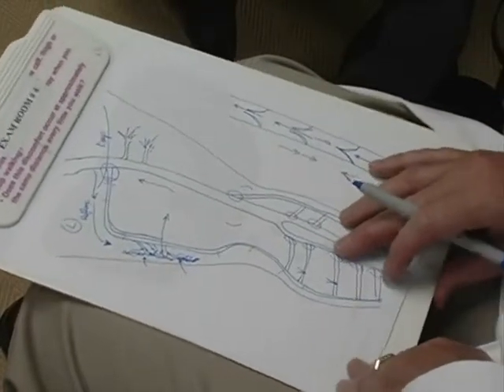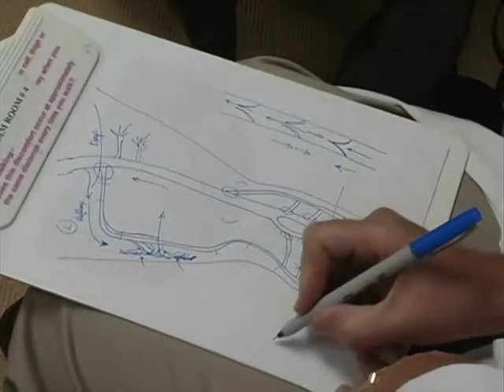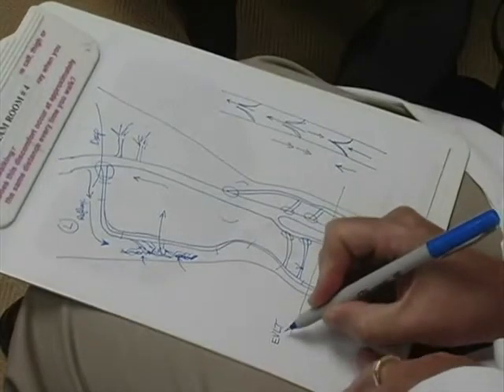In 2002, a new procedure came out. It's called EVLT, or endovenous laser therapy.